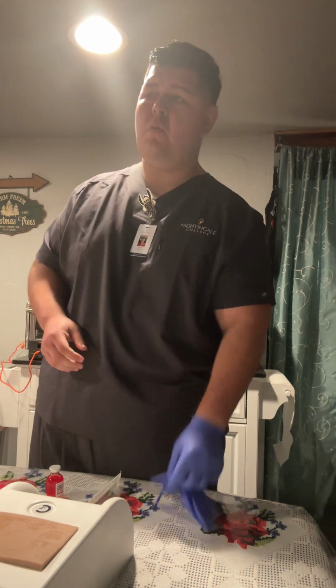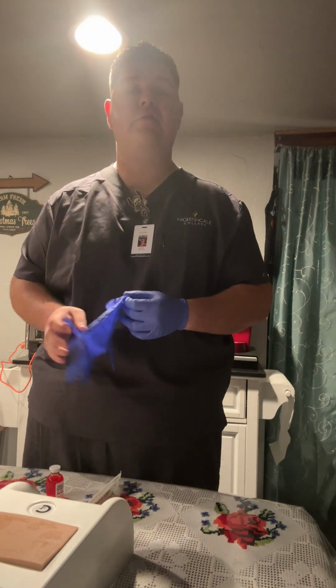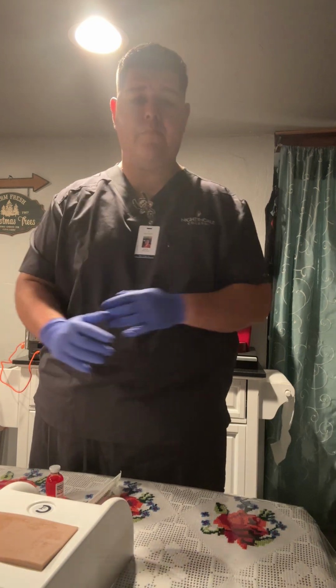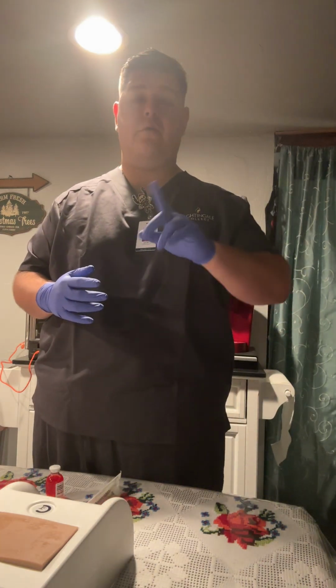Okay, Mr. Miranda, I want to let you know that upon administering the medication, you might feel some slight stinging or burning sensation at the site. This is common, and I just want to make you aware of that. I also wanted to reiterate that the needle and syringe I'm using is a 29 to 30 gauge, half-inch needle with a 1 ml syringe.